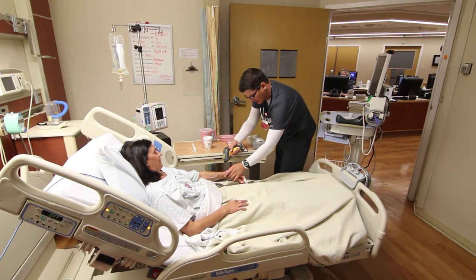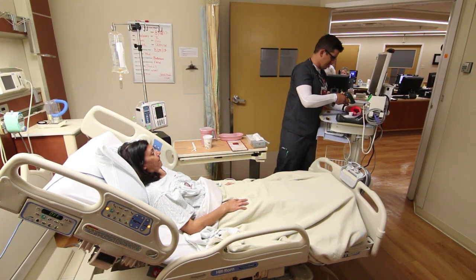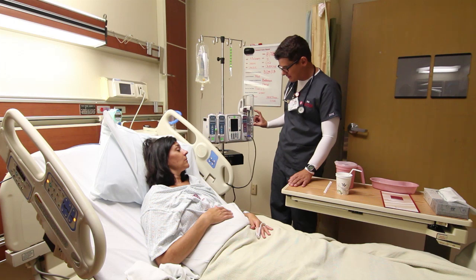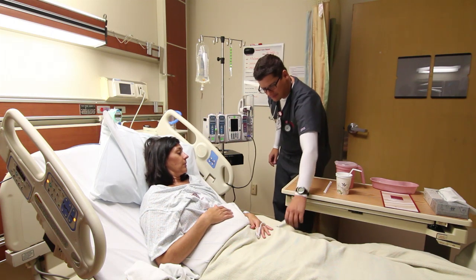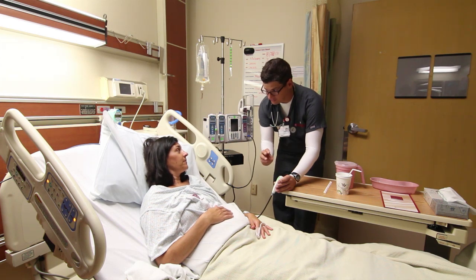Your surgeon and anesthesiologist will collaborate to individualize a plan for pain management. The following are some of the methods that can be used to achieve pain control. Your specific pain management plan may use more than one of these methods. A patient-controlled analgesia, or PCA pump, can be connected to your IV line. It allows you to press a button that releases a dose of pain medication into your vein at intervals prescribed by your doctor.